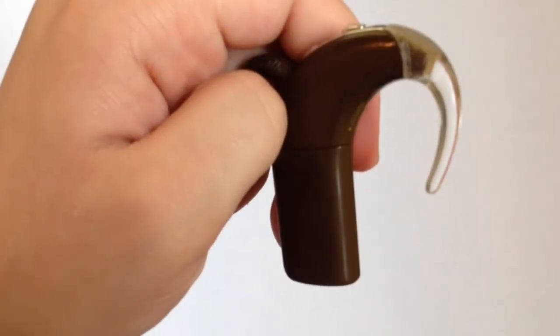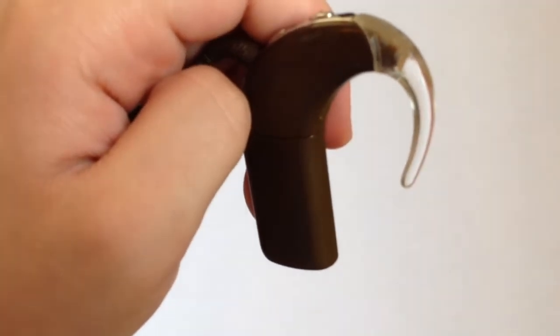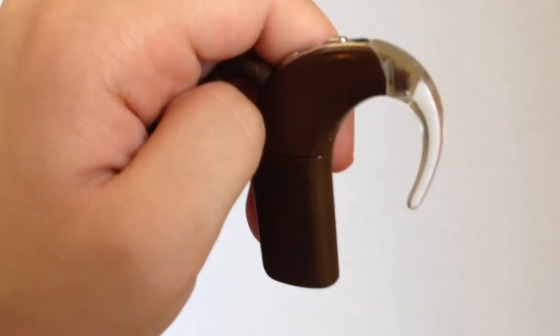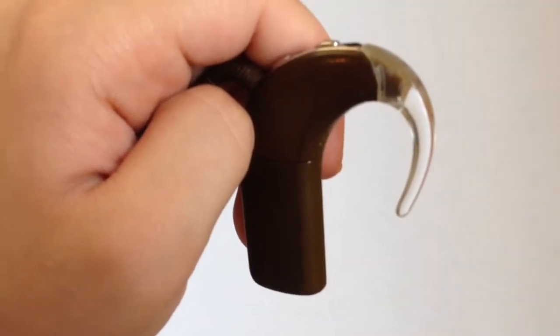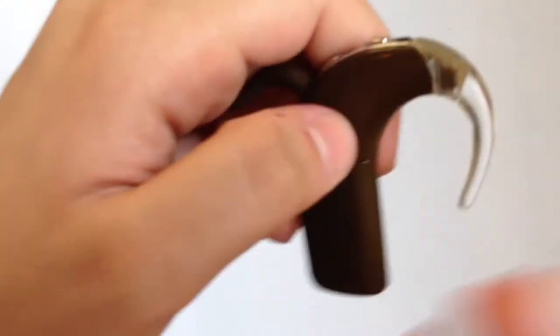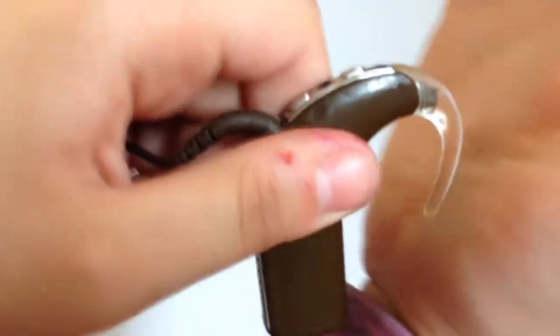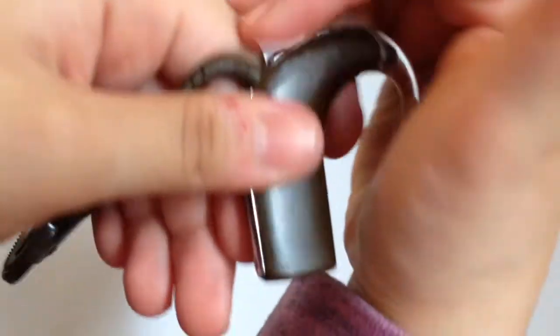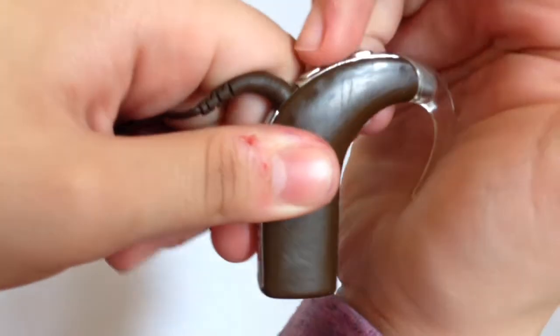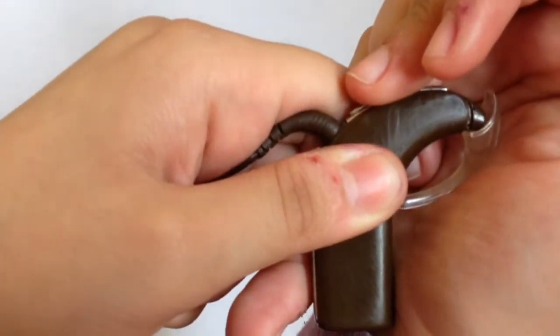So this first method I'm going to show you is not the safest way to go about it, but it works. First, I put my palm on the hook like this, okay? And hold the rest of the cochlear implant like this. And then I just snap it off like that. And it snaps off.